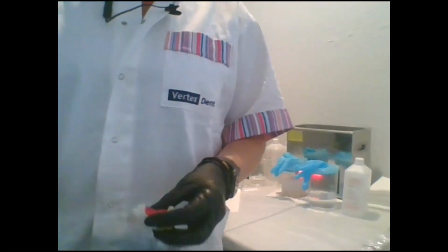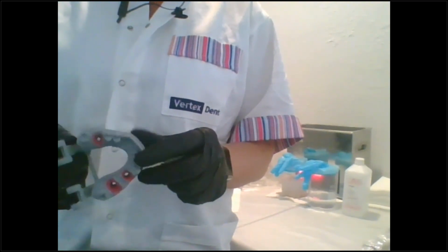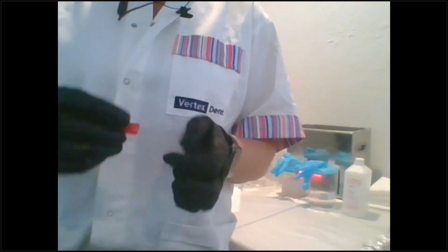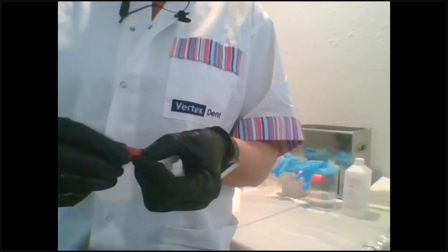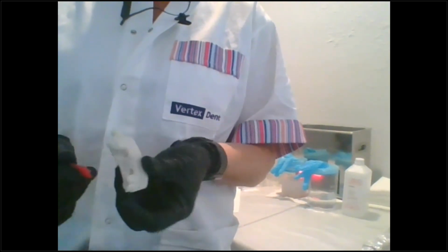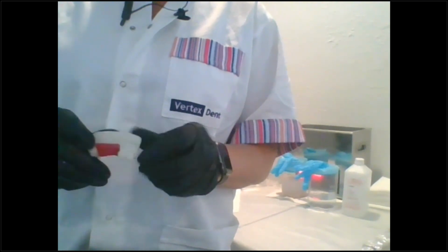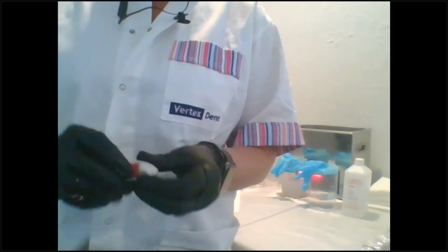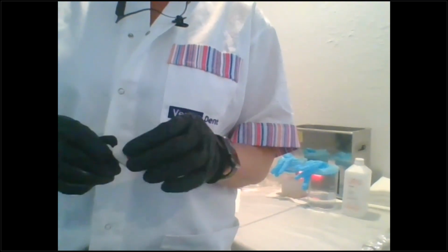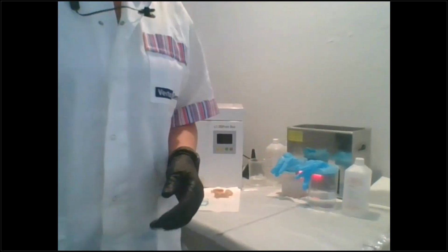And also, there's a few different looks as far as gingiva masks. Some people add their articulators onto their models, and gray and gingiva looks good. So here's your gingiva mask. This is done on ExoCAD. I like to put the little beads, but some people would prefer to have a smoother surface. Fits fine either way. I always keep my gingiva mask about 2 millimeters thick. It's just rigid enough to be able to use it like a GI mask that you use on the analog way. And then obviously you have your peach.